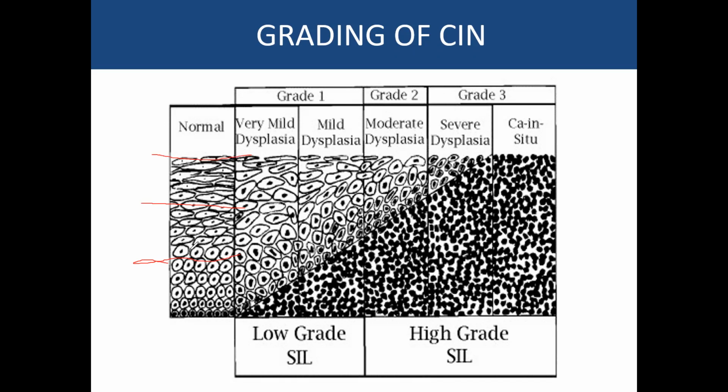In mild dysplasia, you see, this is a normal growth pattern. But when HPV comes in and all those other factors also come in, you will notice that, looking at this epithelium, the cells here look abnormal. Look at how the normal arrangement changes, look at the nuclei. The cells become bigger. Now look at these neoplastic cells.